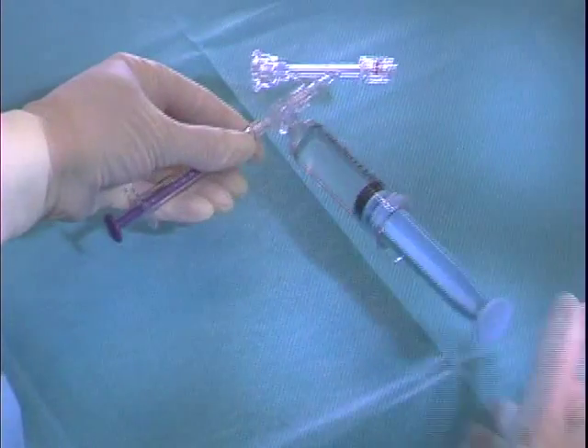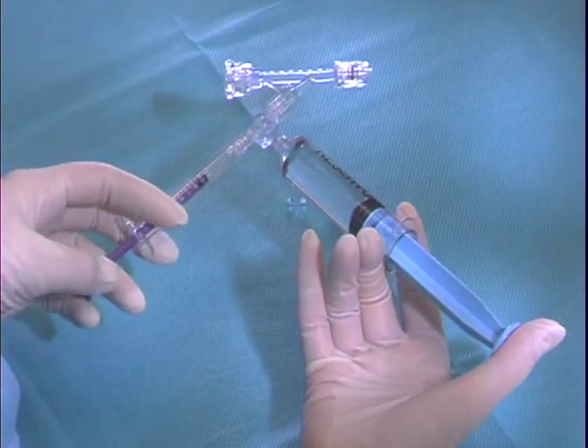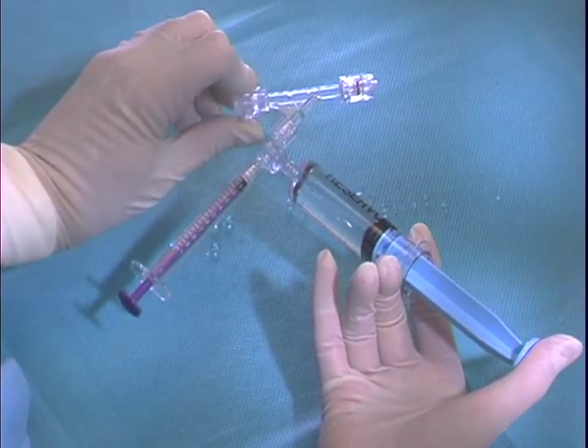If the two-syringe setup with check relief valve is used, assemble the products as shown. Use a syringe filled with sterile saline to flush and debubble the components according to standard hospital protocol.